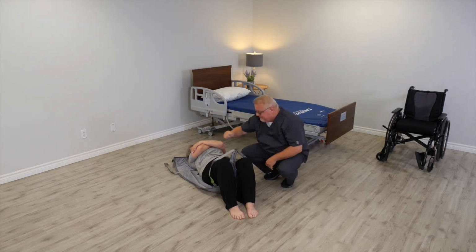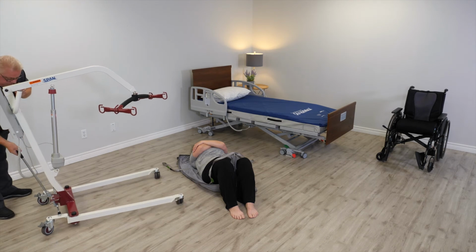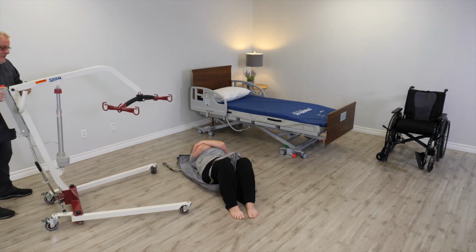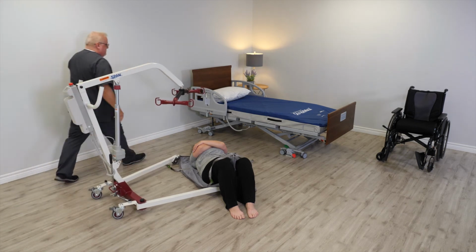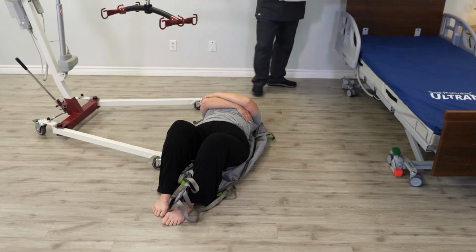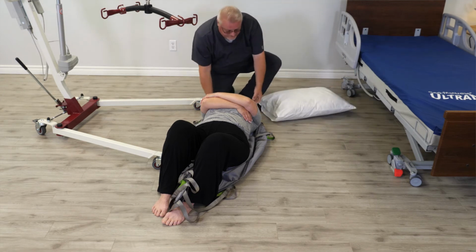Now you are ready to move the lift over. Approach the patient, open the legs of the lift, and position the lift for the floor extraction. This can be done from different directions. For this video, we came in from the side and used a pillow to help protect the head of the patient.